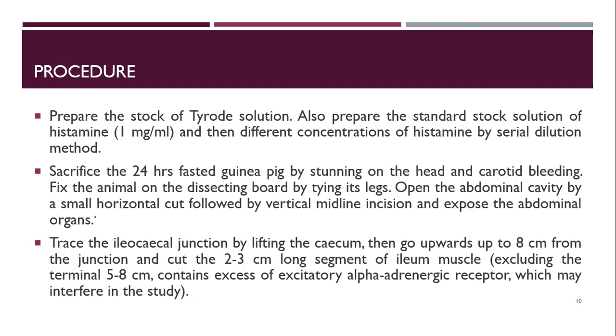Okay, so in order to locate the actual ileum, you need to have very good knowledge of the anatomy of the gastrointestinal tract. So you know at the ileocecal junction, from the cecum onwards the large intestine starts. Prior to the cecum we have the ileum.